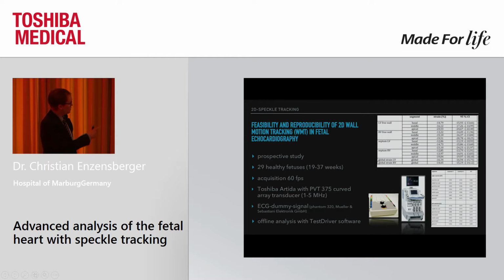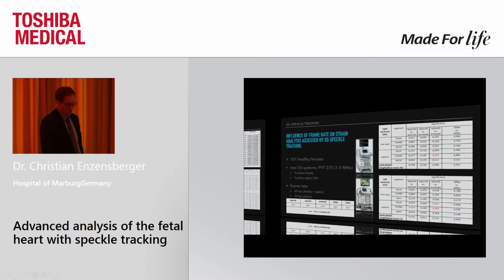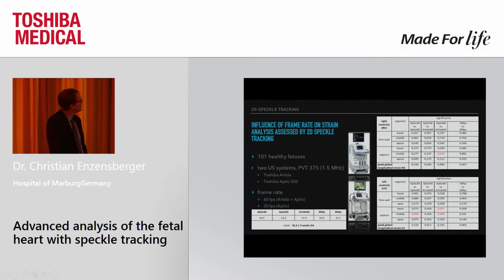Reproducibility, I'm sorry for this tiny table. For inter- and intra-observer variability, we could achieve a very good intra-class correlation, so we could demonstrate that this works quite well.